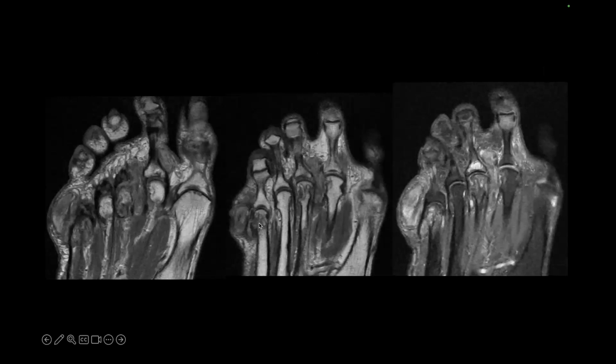We can get it in the feet. So here is a case of multiple erosions affecting the metatarsal heads with areas of active inflammation, such as in the third MTP joint here. And this is a large rheumatoid nodule, which you can get at sites of friction that are forming, so particularly on the hands or the feet.